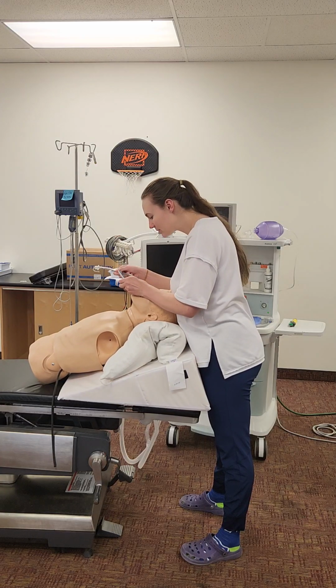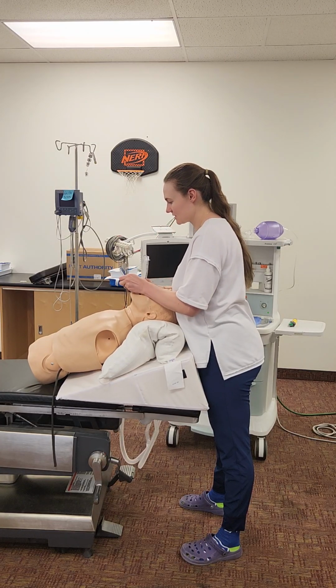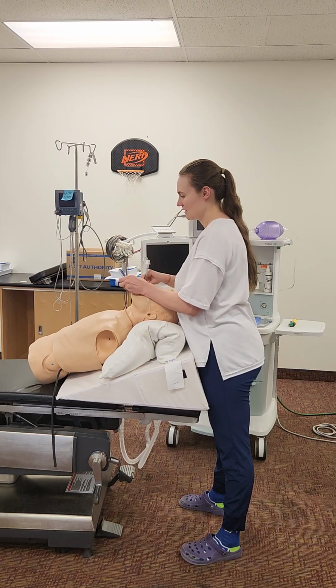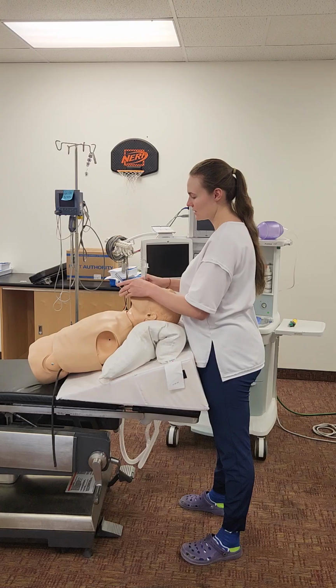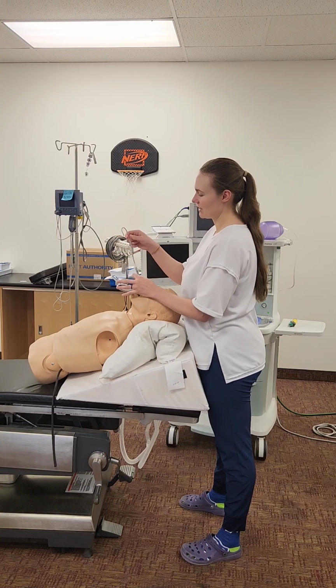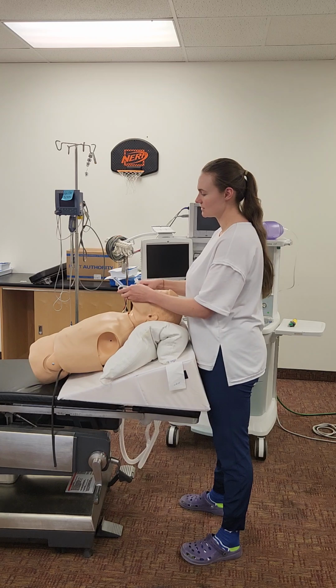All right, and I have a pretty decent view. Trying not to rock on his teeth and just lift up his head. I can see on this monitor that it's going through the cords, and now I'll ask my circulator to pull the stylet, and then I'll put it the rest of the way through the cords.